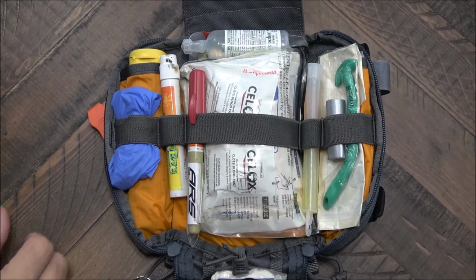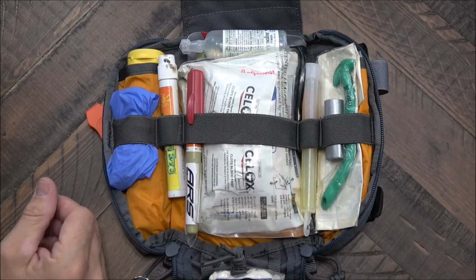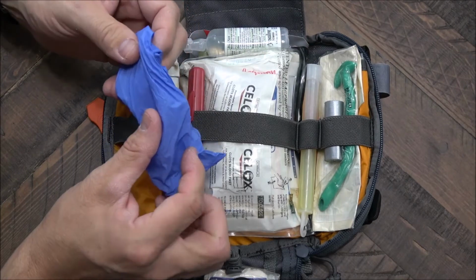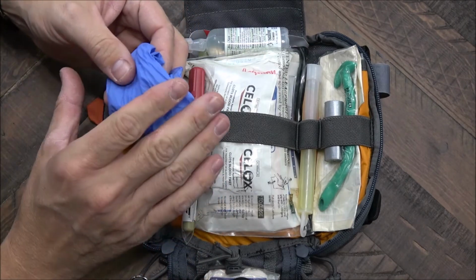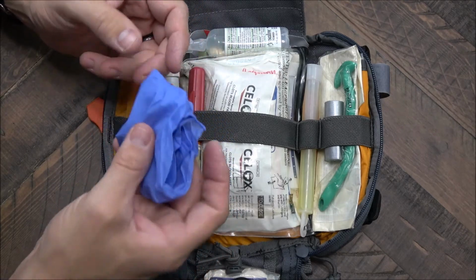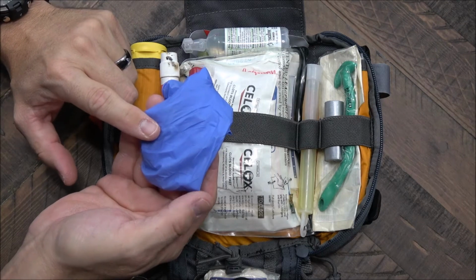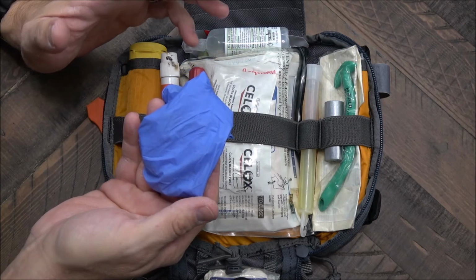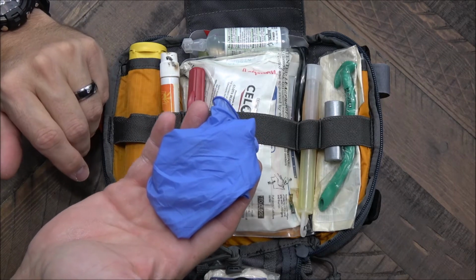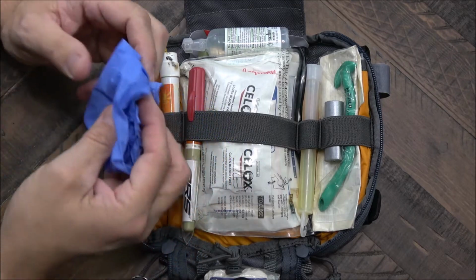All right, let's go ahead and move on up to the top of the kit. What I'm going to do is start here on the left side of the IFAK and work my way to the right. You'll notice that I've got an additional pair of gloves. This is important because if I need to change out my gloves because my previous pair are too saturated with blood, I've got a fresh pair. Also, if I've got somebody else that is willing to help me, maybe I need them to hold pressure on a wound, whatever the case may be, I've got an additional pair of gloves. So now I've got two people working on a patient, which expedites that care.